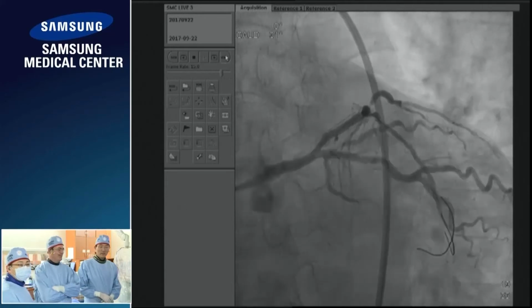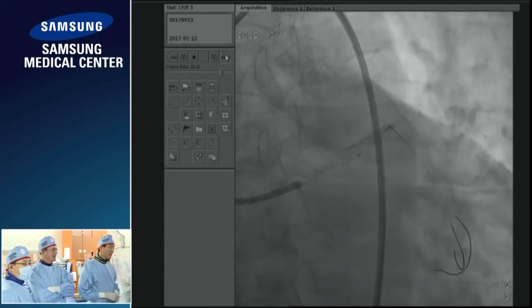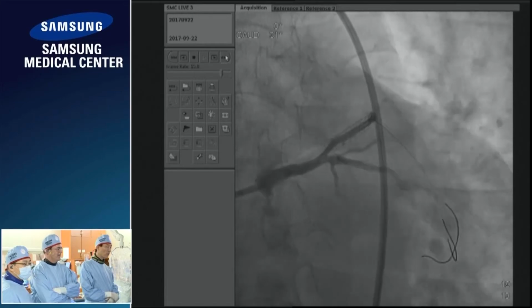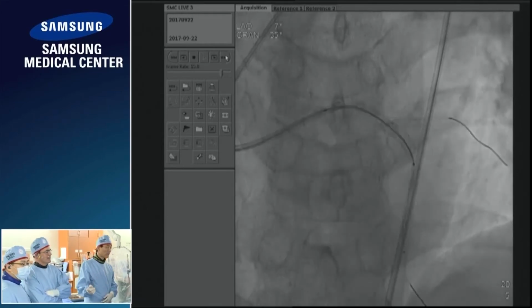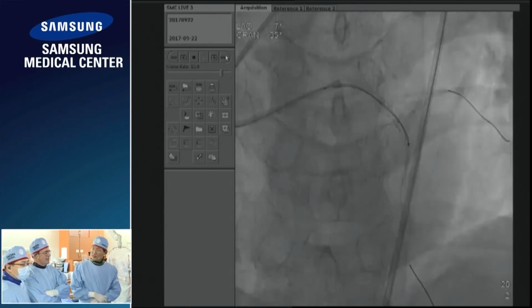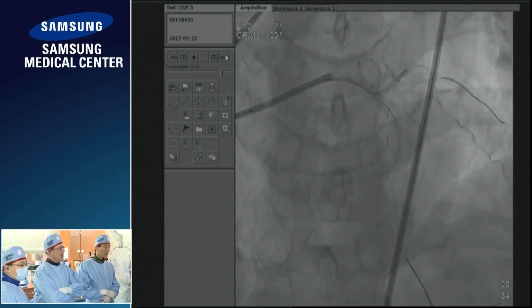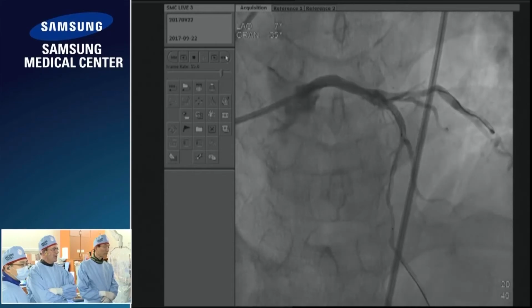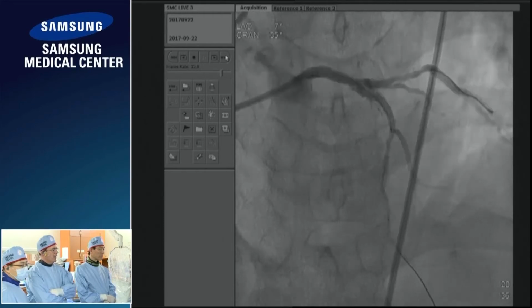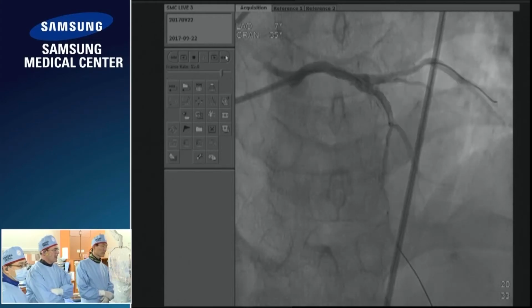Okay, I'll explain what has been going on in this cath lab. So, angiogram, this is just the point that you left. We dilated with a 3.5 balloon. Next, OCT was done. And what was the finding at the time? So the OCT finding with the LAD: a substantially bigger vessel than had been thought at the initial stenting, so a 3.5 to 4 millimeter vessel proximally, and distally, just beyond the bifurcation, the vessel is also 3 millimeters in size.